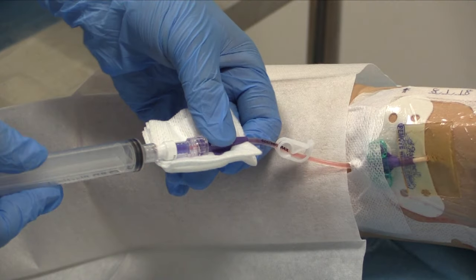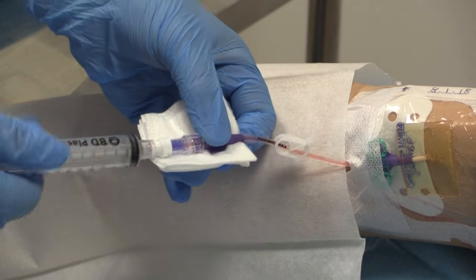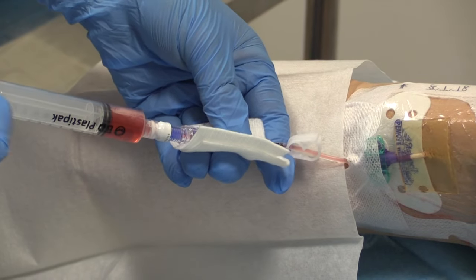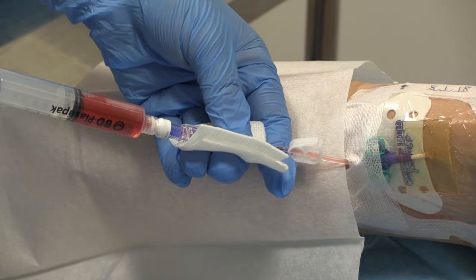Using the second empty 10ml Luer lock syringe attached to the needle-free device, whilst applying positive pressure on the syringe, unclamp the line and withdraw your blood sample. Alternatively, you could use a StarStack connector to the valve and then use blood bottles to syringe off the blood. Whilst withdrawing the last 1 to 2 mils of blood, re-clamp the line. Please note: never pre-vacuum a blood bottle for use on a CVAD as it will result in too high a suction on the line and cause the lumen to stick together.